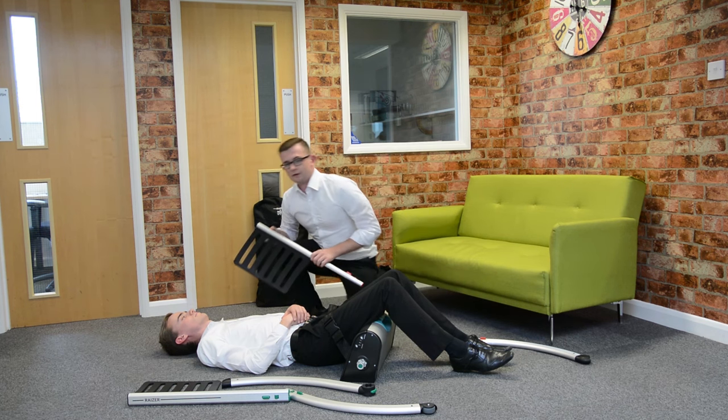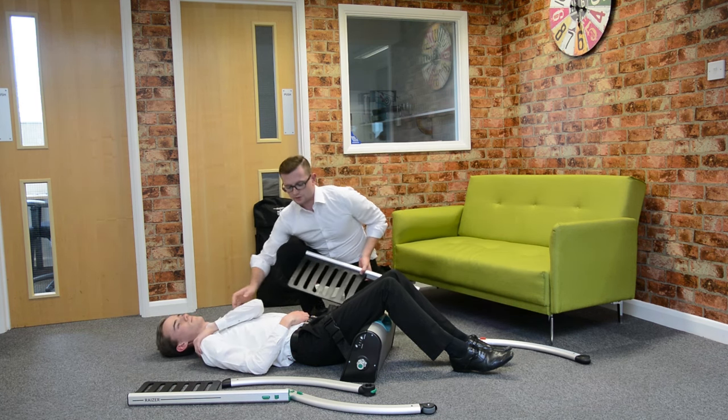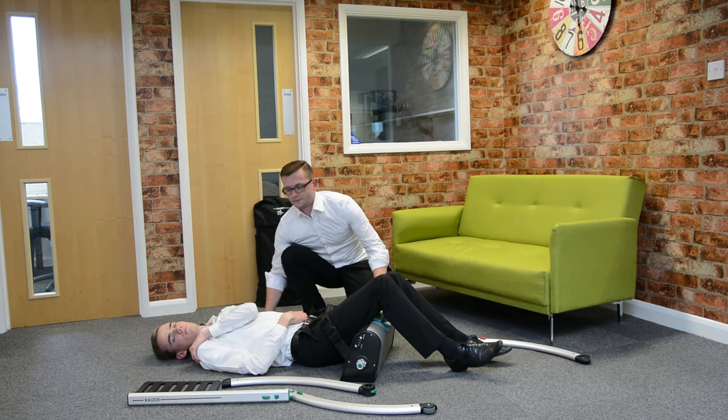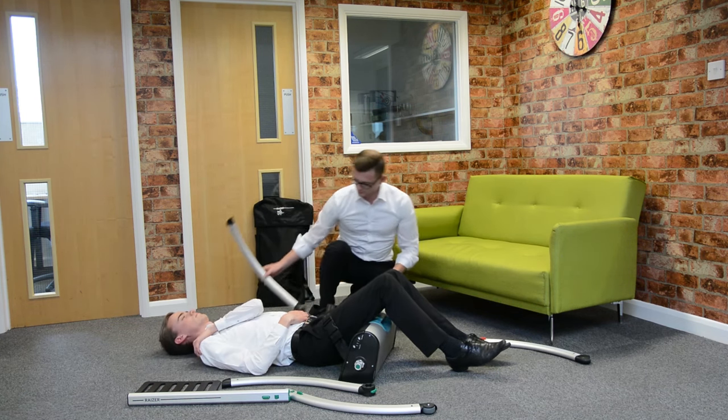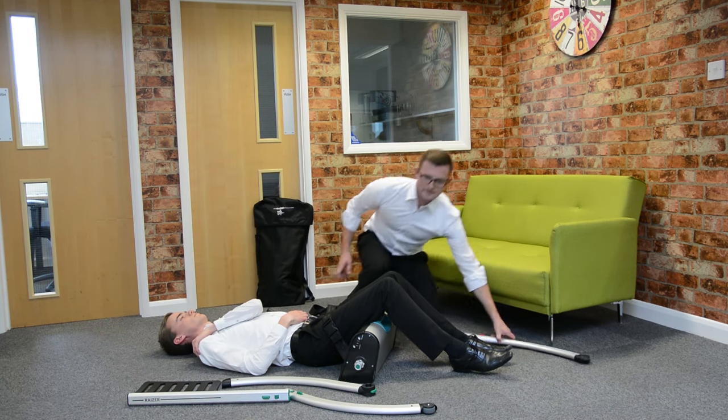We'll start with the backrest. If we put the patient's arm across with the opposite shoulder, it slides into place. Then a lifting arm and leg.